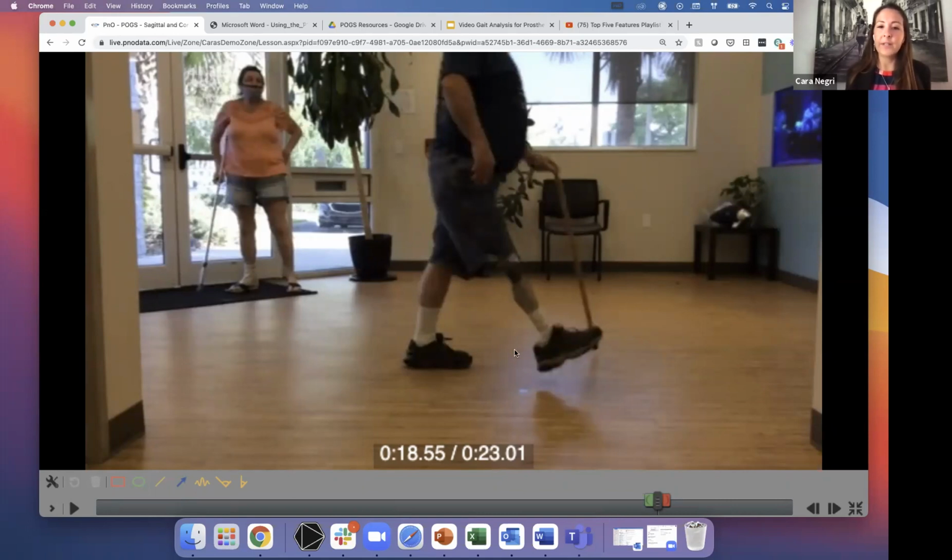He doesn't have confidence in this knee anymore. It hasn't been functioning very consistently for him. He's pretty rough on it. He says it's very intermittent when he feels the support. So that makes a lot of sense to me why he's kicking it so far out there.